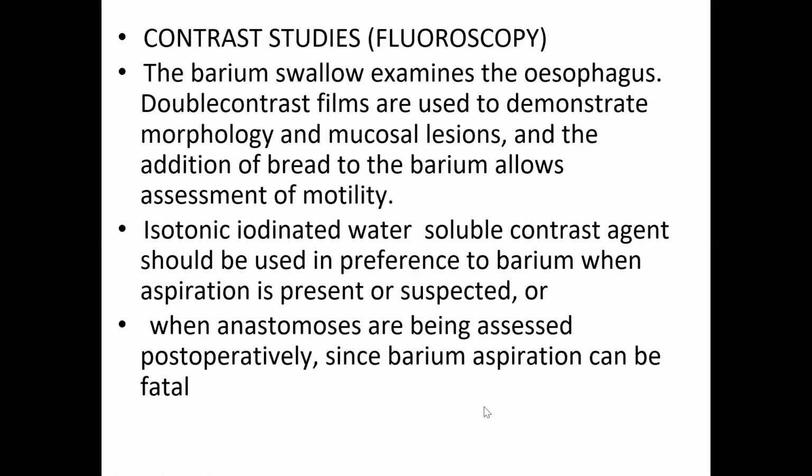Once again, you should keep in mind this contrast study, a very important fluoroscopic study. This is called fluoroscopy, wherein the barium swallow helps in the examination of the esophagus. As you could see, the rat tail appearance, or the bird beak appearance of achalasia cardia, all these things will be seen in barium swallow only. Next, double contrast films.